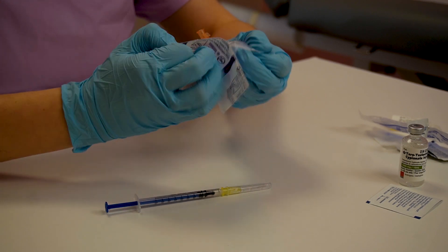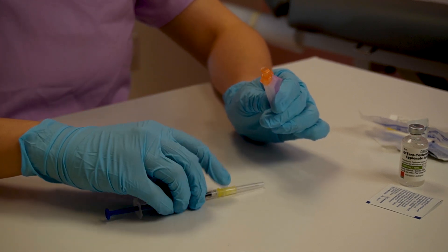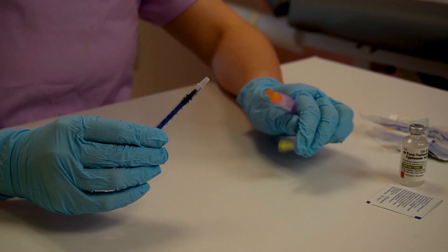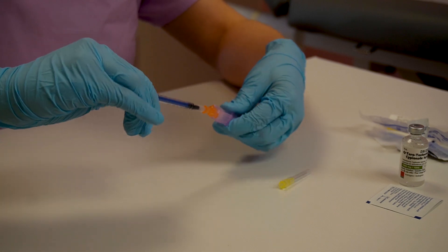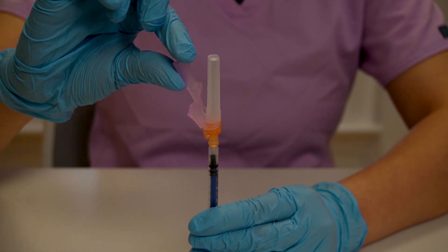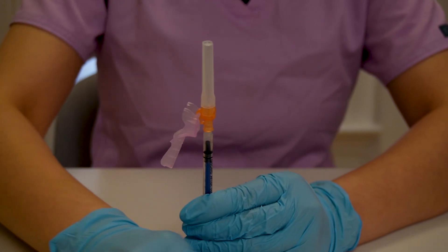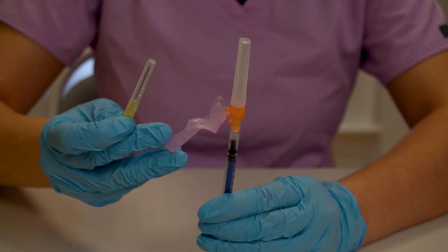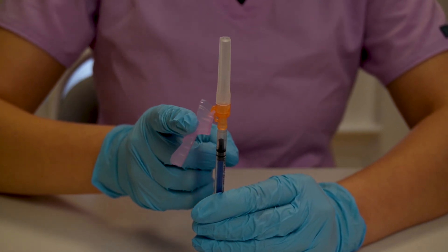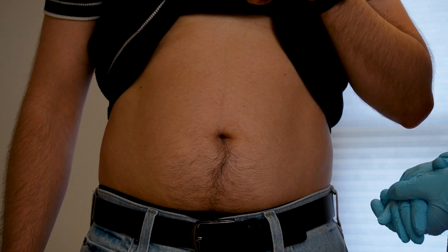Unwrap the new needle and make sure that you're not touching the sterile part — you don't want to touch the yellow part of the needle or the orange here. Untwist the first needle and twist in the new one. This needle is a bit different — there is a special safety tool. Pull it down a little bit so it's not in your way. Some needles have a small pink one, and some have different designs where you just need to push a little bit. Make sure you do some investigation on your needle first so you feel comfortable.